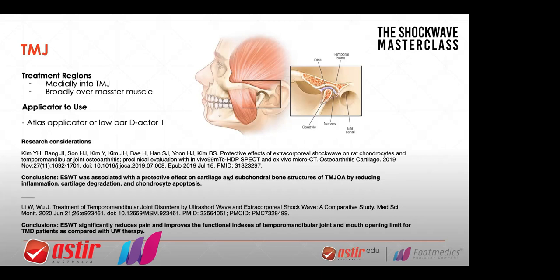I also use it over musculature. You can do it over the temporalis, but don't forget that the temporalis is right over bone and that can rattle the brain a little bit, so I don't do it there so much. I mostly do it on the masseter using the Atlas or the D-actor. You can brush through that masseter muscle from the back all the way through — about 500 to 800 shocks. Within their limits, I wouldn't be getting up to two bar — probably about one to 1.5 bar, wouldn't be more than that for the masseter.